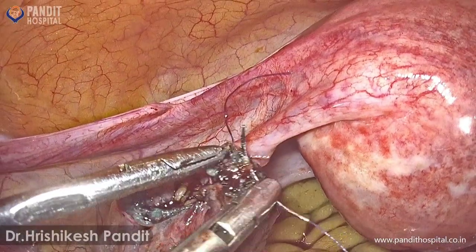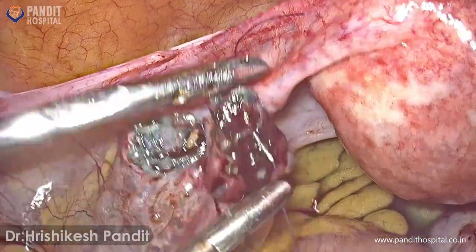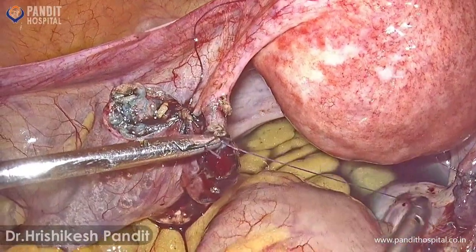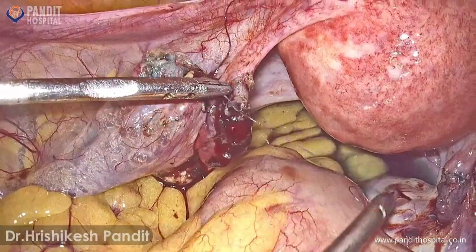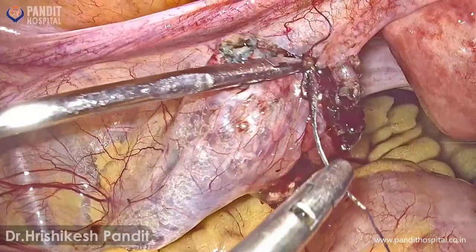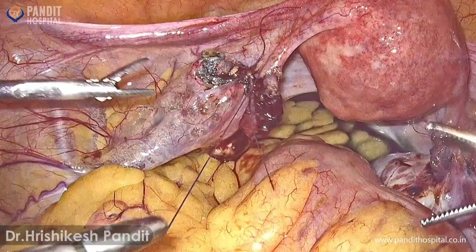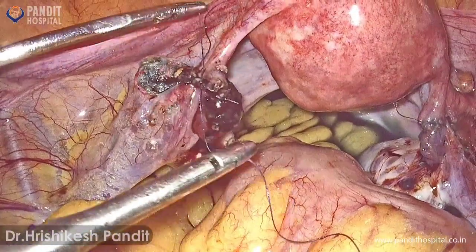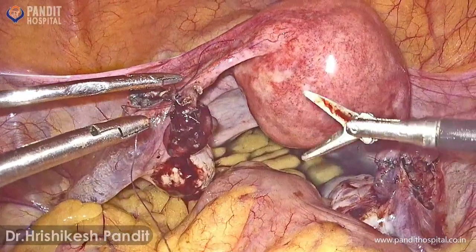Now I am taking the 12 o'clock stitch. Depending on the lumen size, we have to decide whether to take three or four stitches through it. In this procedure, 3D visualization is going to help a lot with depth perception. Now we are going to close the serosa. Some amount of leak is acceptable — when the tissue heals, that leak will get sealed.